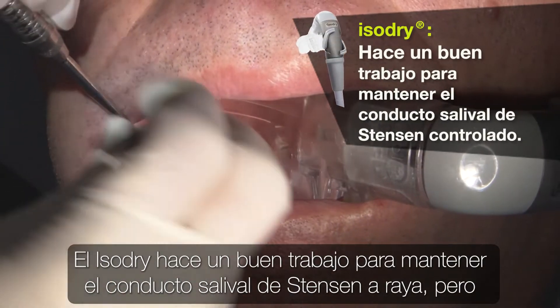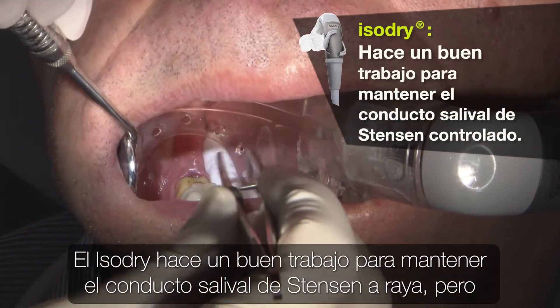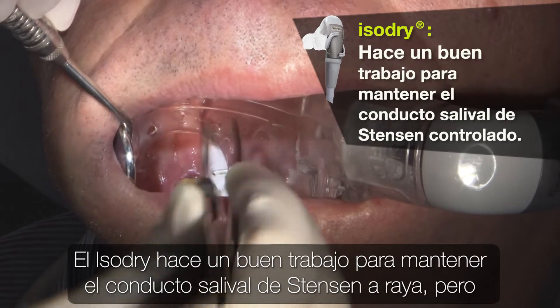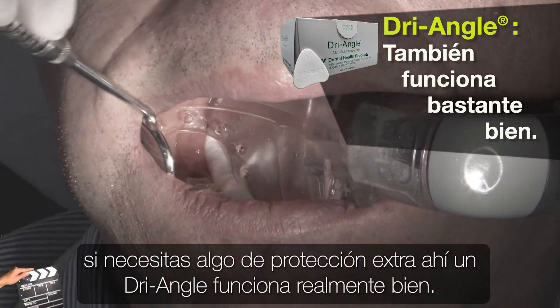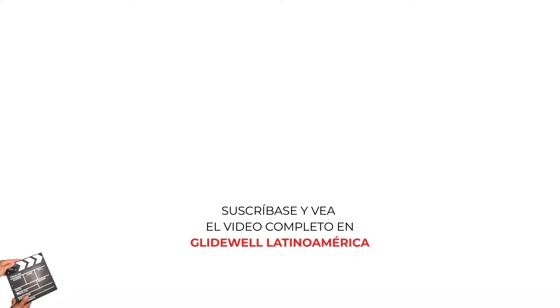So the IsoDry does a pretty nice job to keep that Stensen's salivary duct in check, but if you need some extra protection there, a Dri-Angle works really well.